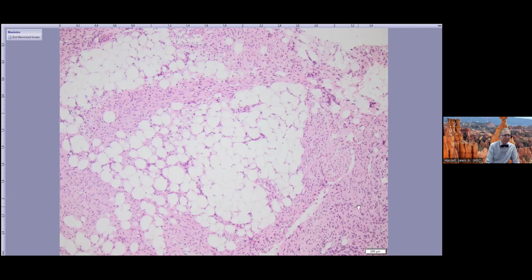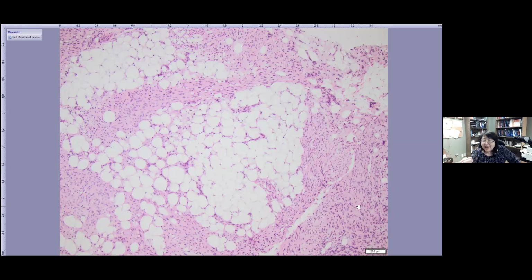Spindle cell lipoma also usually happens in adults. Right. Yeah. In children we usually see more soft tissue tumors than in adults, since we have fewer lipomatous tumors, like regular lipoma. We do not have as many as adults. We do have spindle cell lipoma when there is some syndrome, but in general, fewer lipo tumors. Only a few lipo tumors.